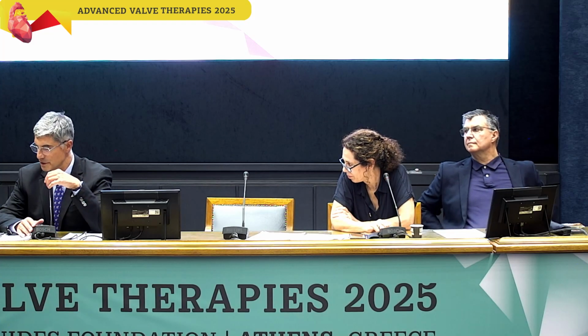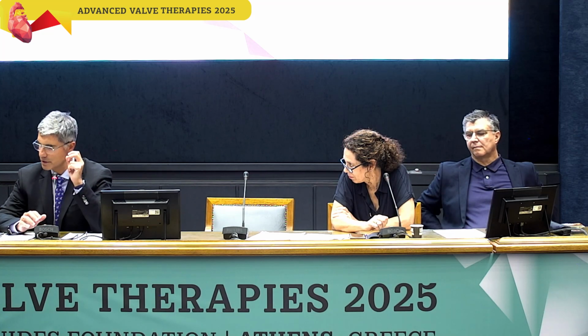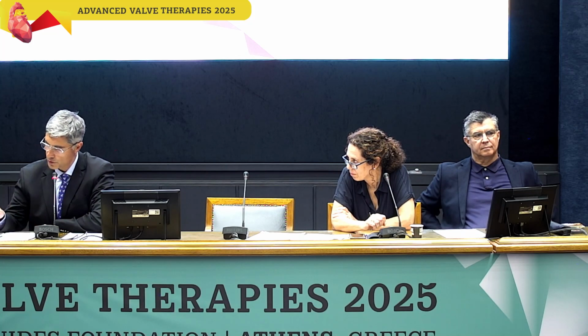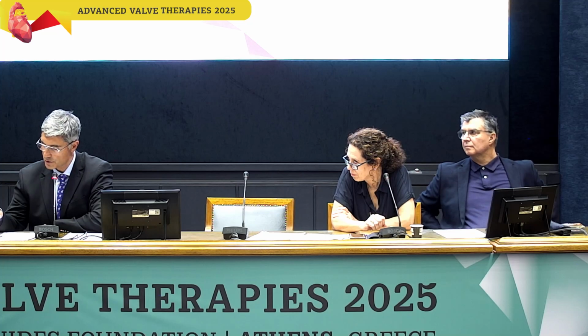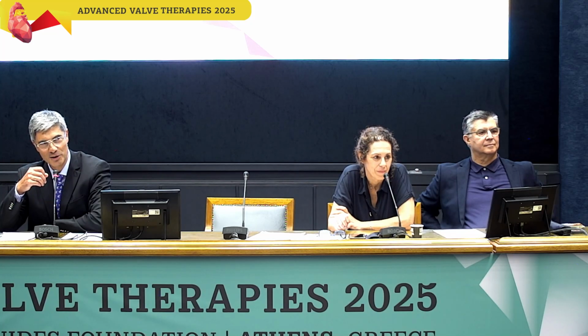Very nice, Dr. Perlepe. So this presentation is open for discussion, and I have to remind the colleagues that they are streaming. We have 314 now streaming. So feel free to ask anything on the chat box. Dr. Nignos, you have a lot of experience in paravalvular leak closure, right?